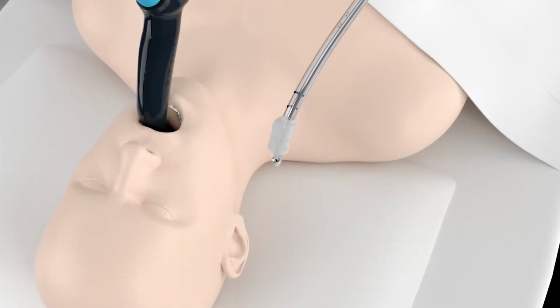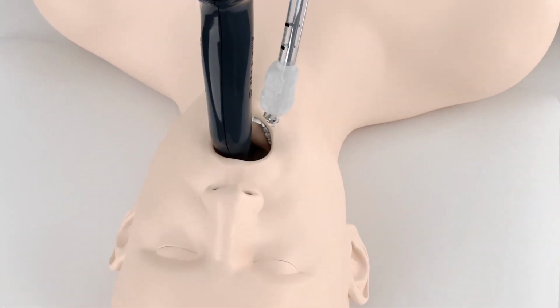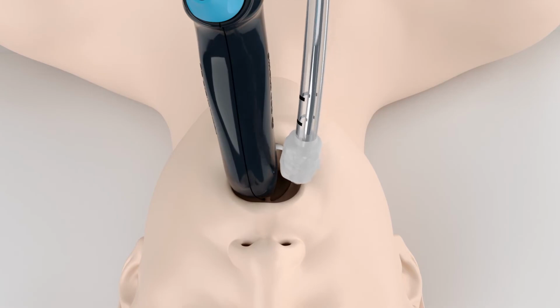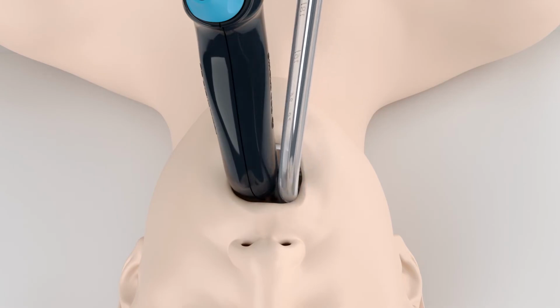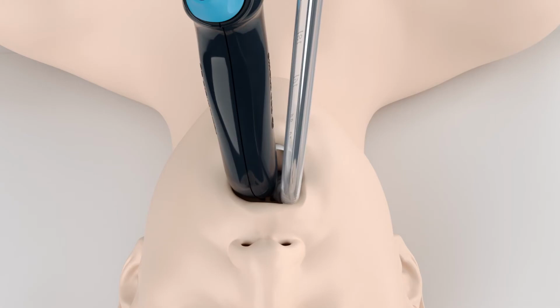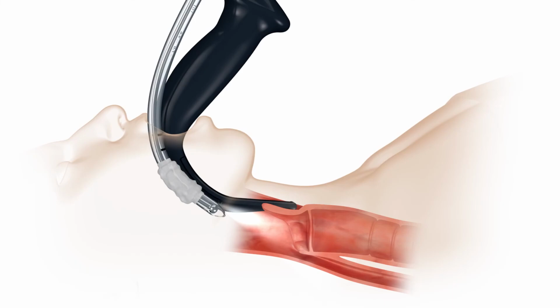The endotracheal tube, which in this case is shaped by a Glide-Rite stylet to complement the angle of the hyperangulated videolaryngoscope, is inserted until the distal tip of the tube is no longer visible with direct vision. Only then should you return to looking at the video monitor.